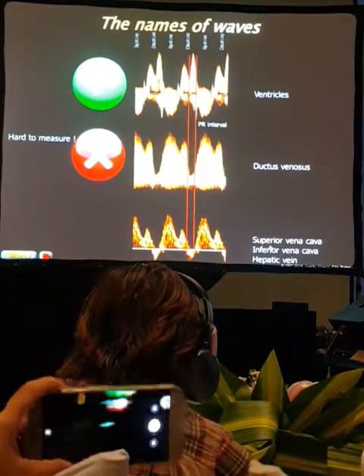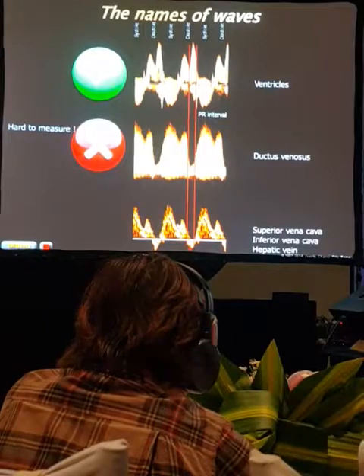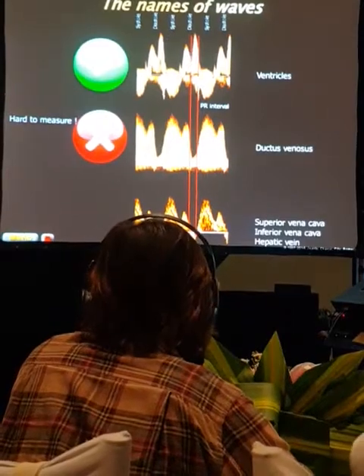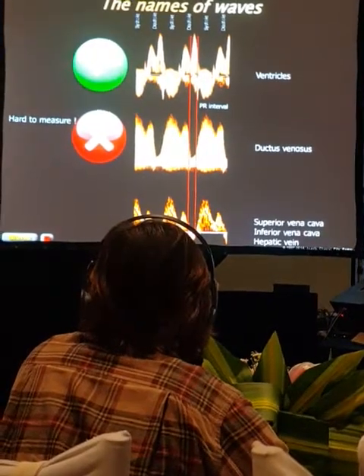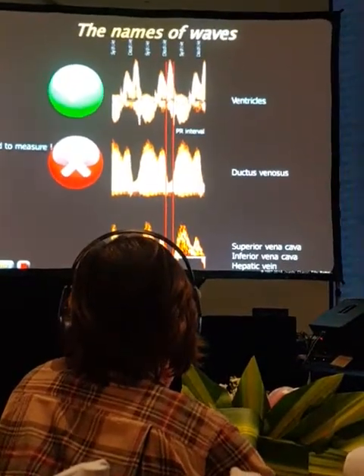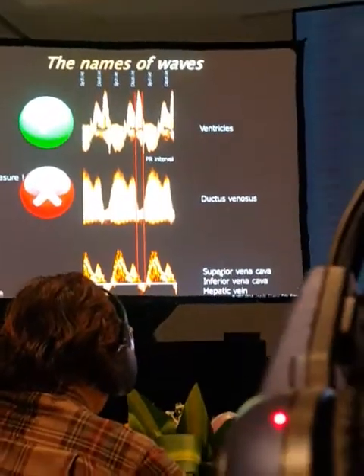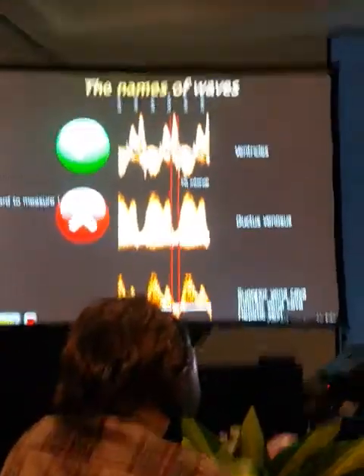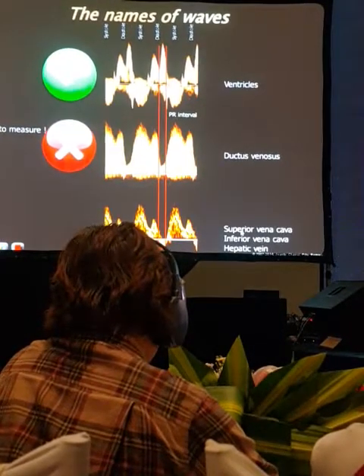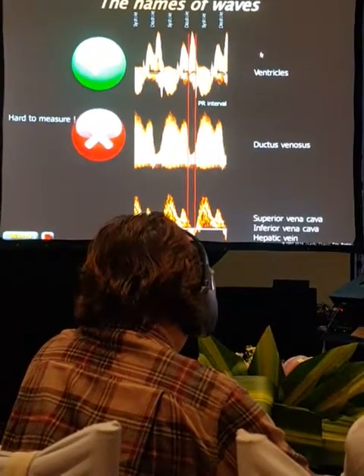If you look at the vena cava, very interestingly, not only can you recognize the onset very well, but you can see that the E wave and the A wave are in opposite directions. Remember, this is obtained in the ventricle, so E is filling into the same direction as A. But when you look at the cava, let's assume that I'm at the entrance of the superior vena cava into the atrium. During E, I'm going to drop into the atrium, into the ventricle, but during A, I'm going to be pushed back into the brain.